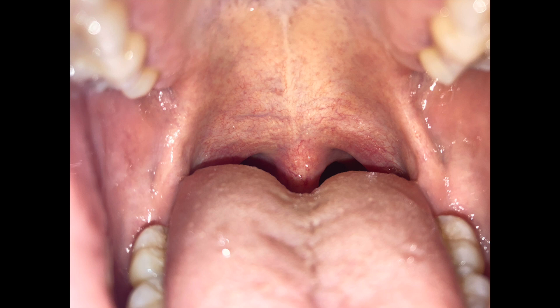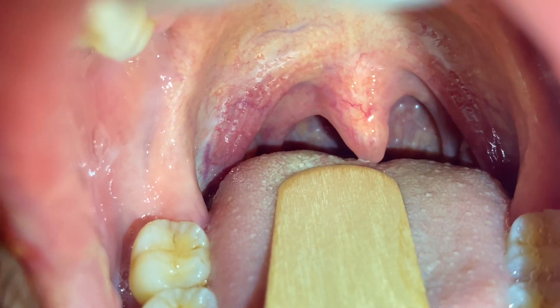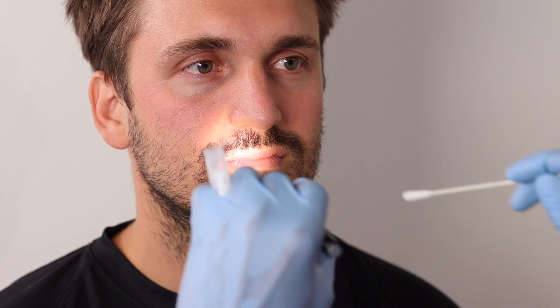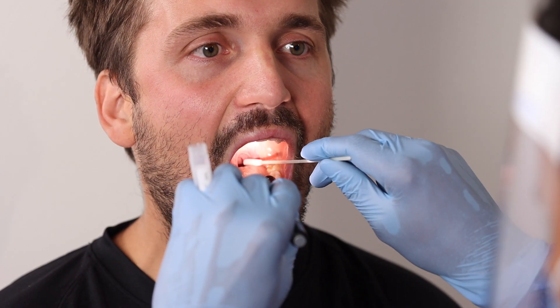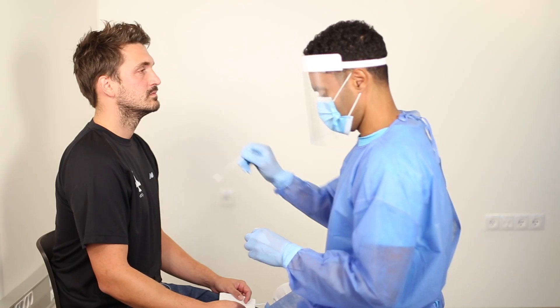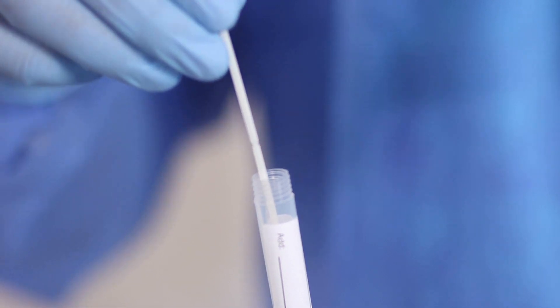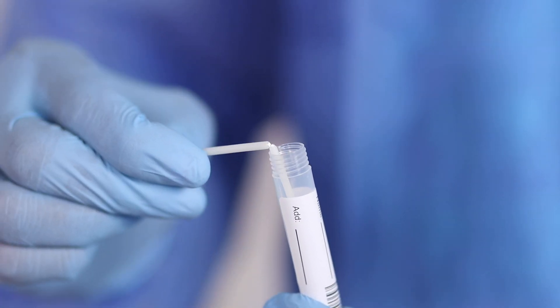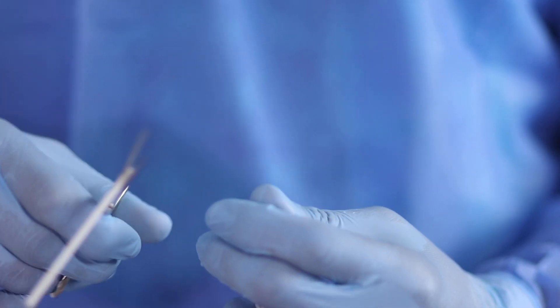If visualization of the posterior oropharyngeal wall is obstructed by the tongue, use the tongue depressor to provide a better view. If there is too little light, use the pen light to improve visualization. Place the tip of the swab into the vial and aseptically break the shaft at the marked weak point or cut with a scissor to an appropriate length.